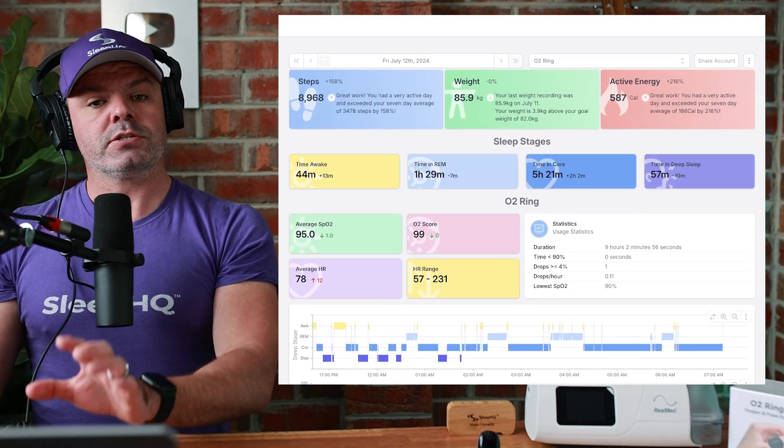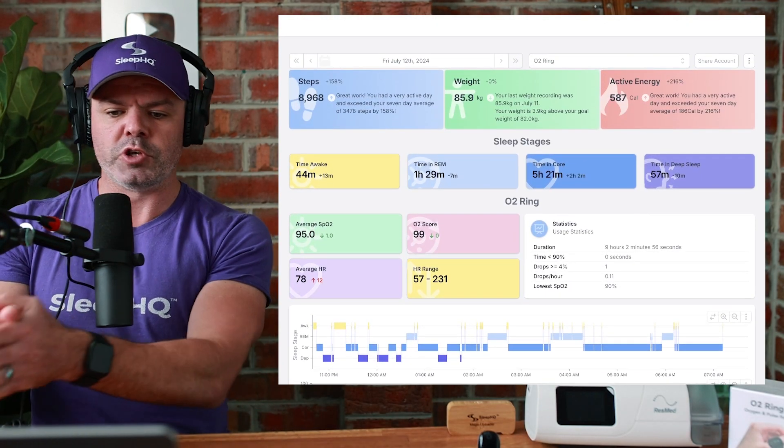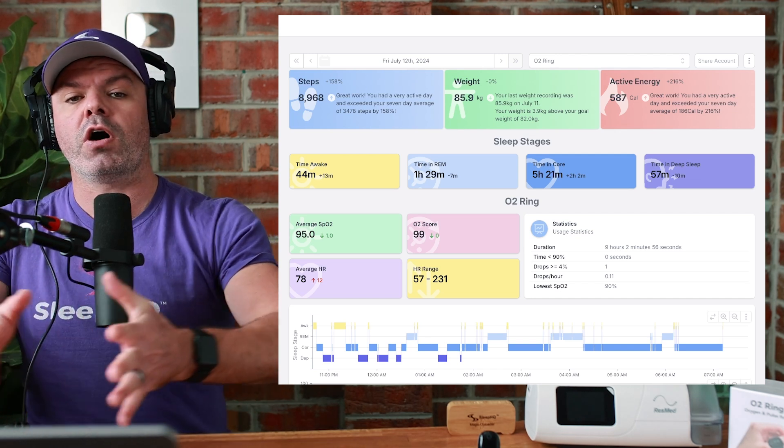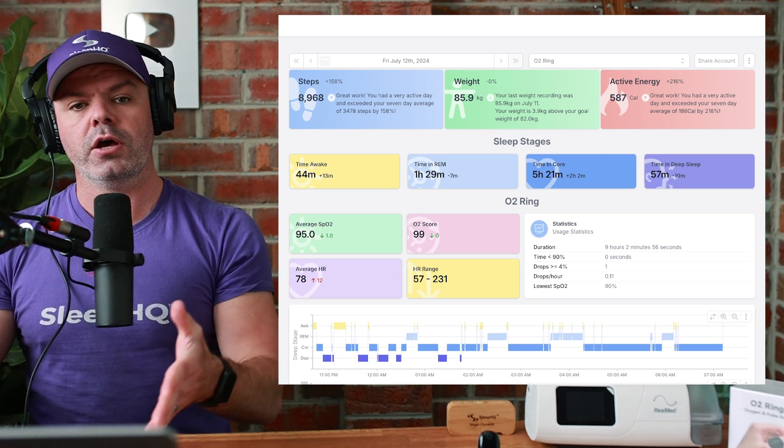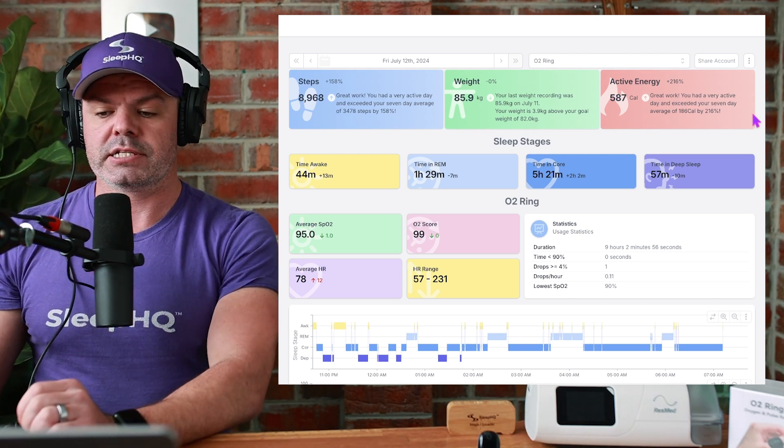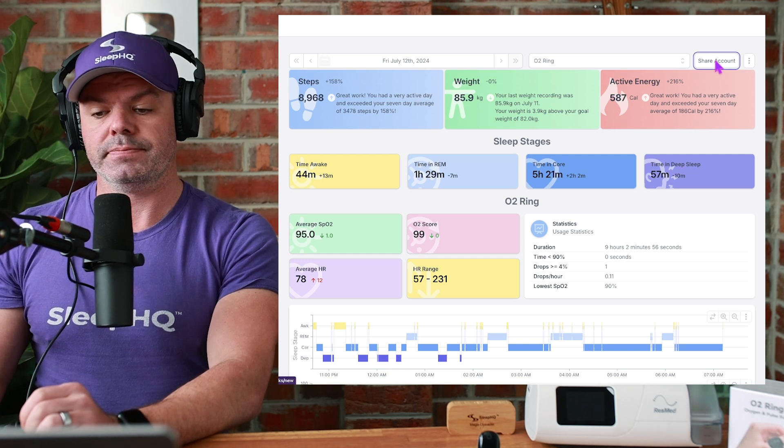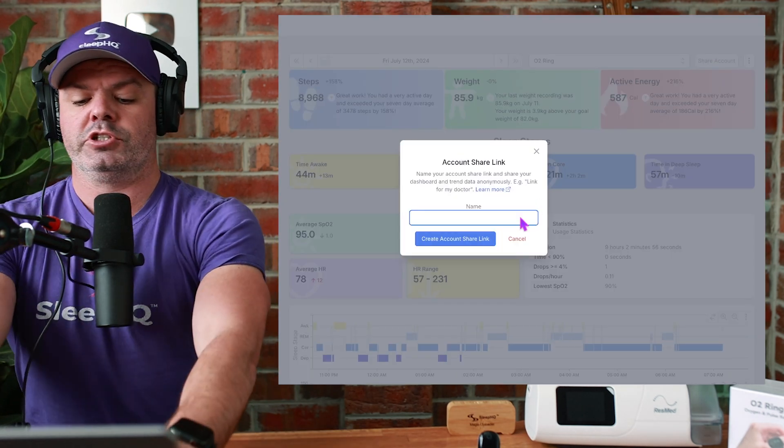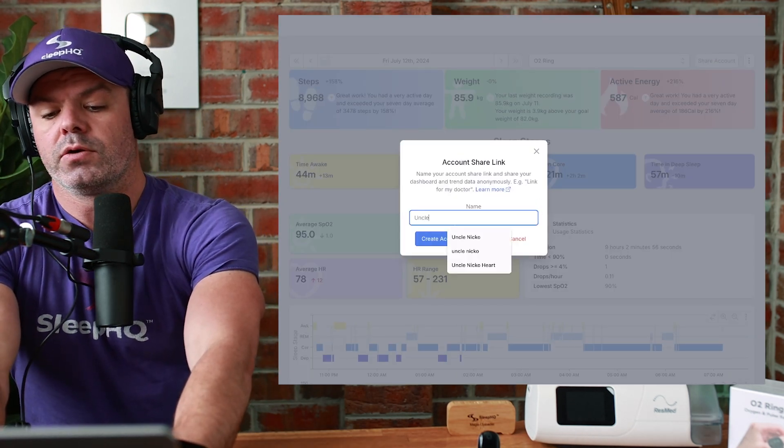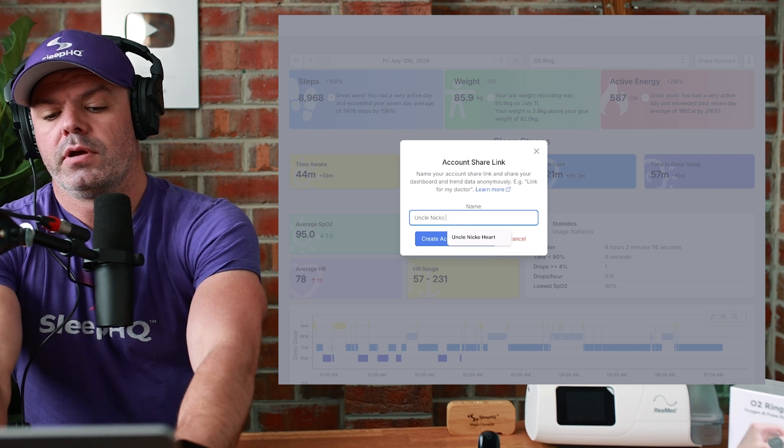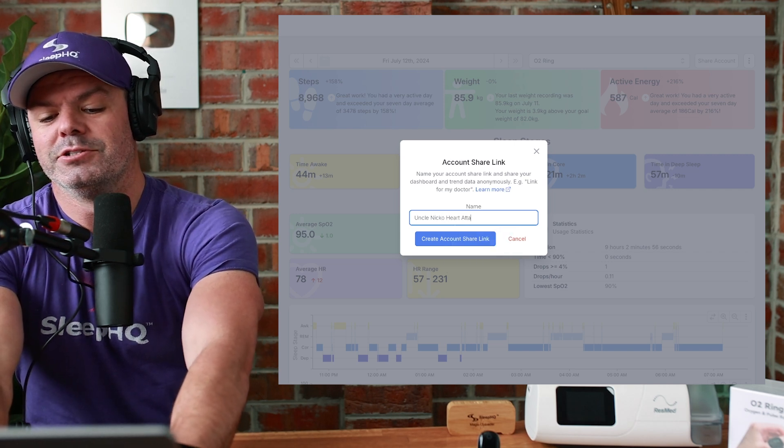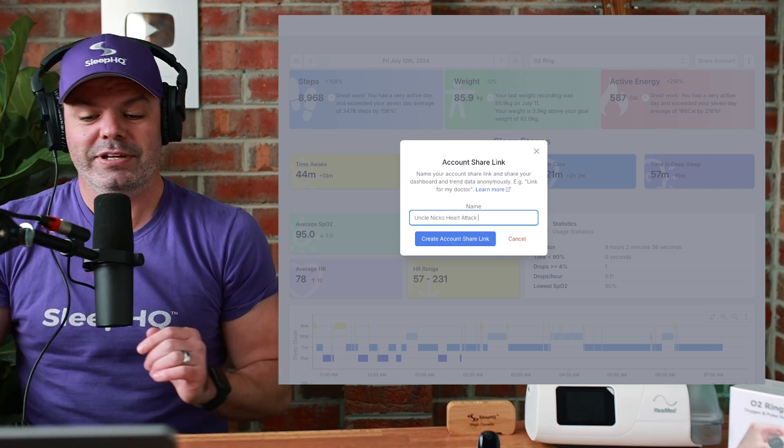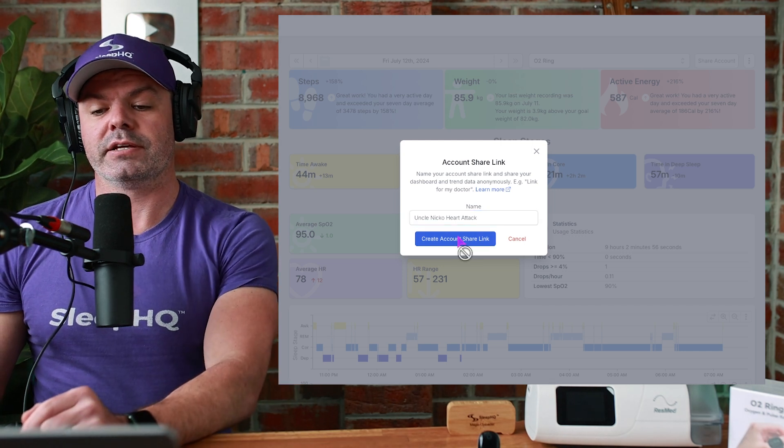But check this out. Yes, it's cool to be able to share a page or a zoomed in link. But you now have the ability to share your entire history, all your charts, all your devices. Just come up here to share account. Give the account level share link a name. Uncle Nico heart attack. I shouldn't joke about that. Touch wood.